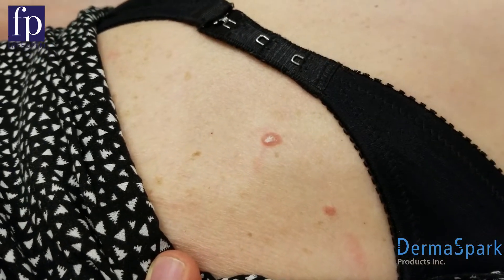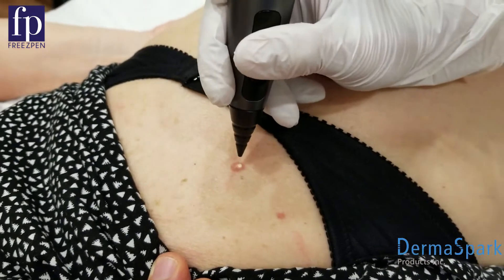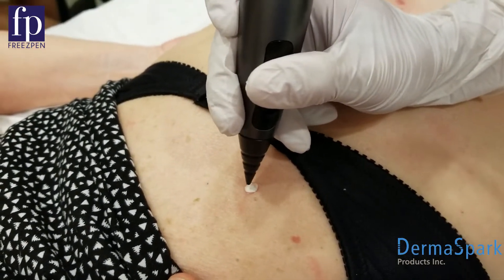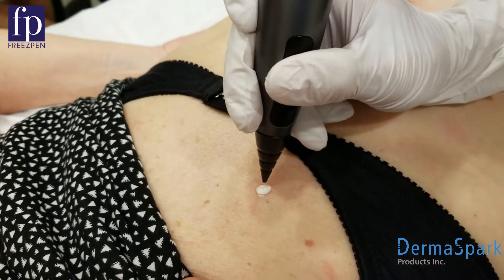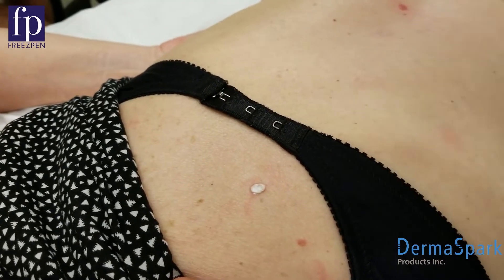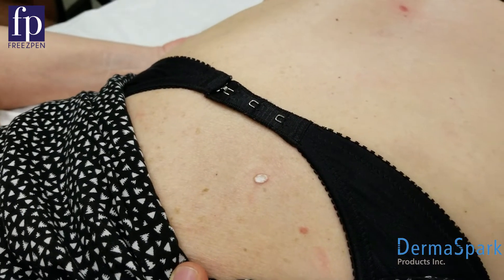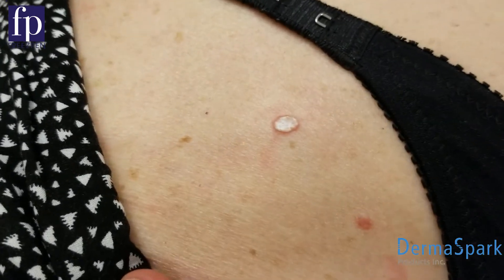Before it's dissipated all the way, I will start that second cycle so I can do a little bit of a longer treatment, because there is no collateral damage to that healthy tissue. She'll see some results within the next couple days — it will turn very red and then a darker purple color, and it'll peel or flake off within the next two weeks or so.